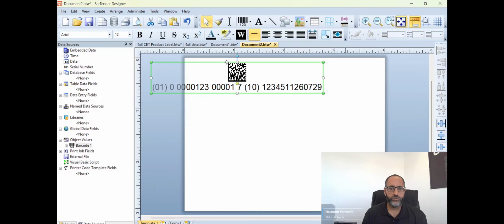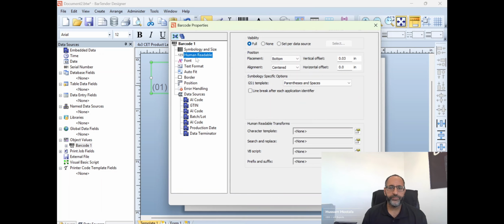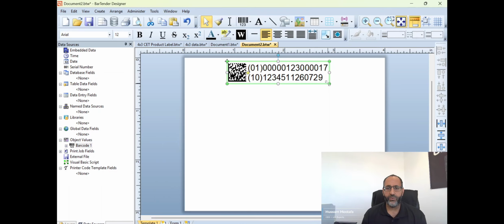Okay, so now if we click close, now we have the 2D data matrix and all the data associated with it. So now I'm going to put the human readable on the right of the data matrix. So I'm going to double click on this and we're going to go to human readable. The placement, we're going to make it on the right of the data matrix. And then the alignment, we'll just leave it centered for now. The GS1 template, parentheses and spaces. I'm going to just leave parentheses only, where it just shows parentheses and the numbers next to it. And then we'll choose line break after each application identifier, such as the global trade item number, the lot number, the production. So it's going to organize it accordingly.